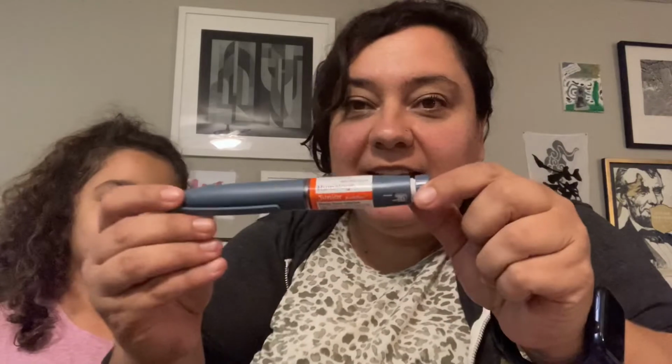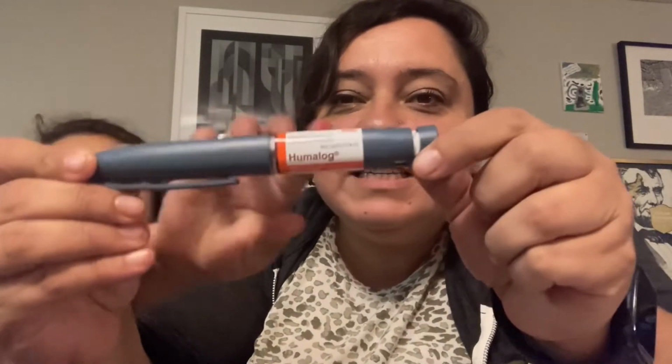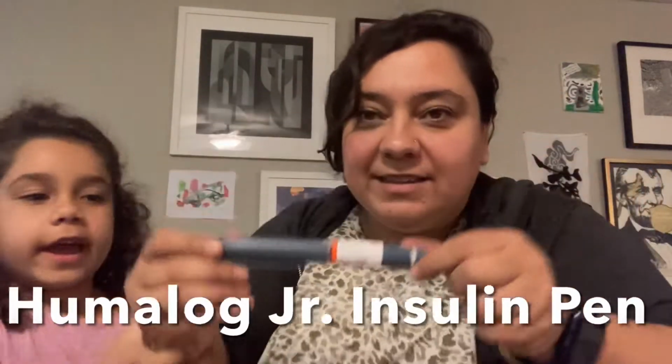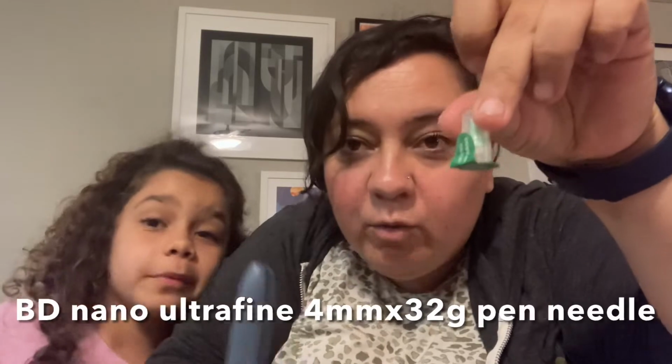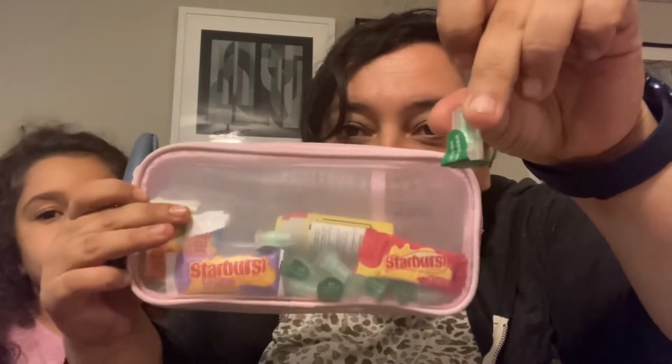So here are your supplies. This is the insulin pen. You can see it says Humalog. That's the medicine. And the insulin pen is going to be the main tool you use when giving a shot. Okay, so we have the pen, and this is what is known as a pen needle. It's very small and very sharp. We're going to have a bunch of these pen needles in our special diabetes bag, plus a couple Starbursts, which are really tasty.